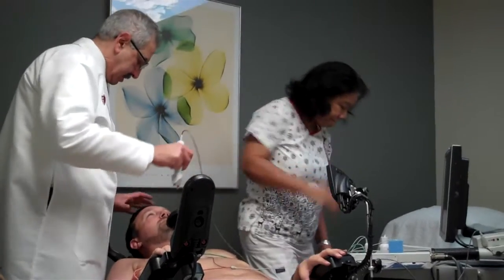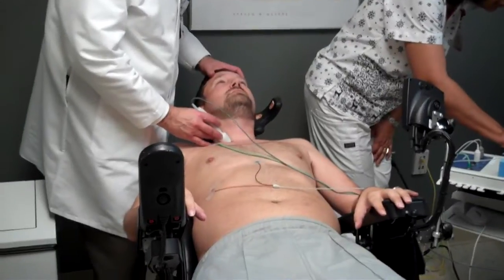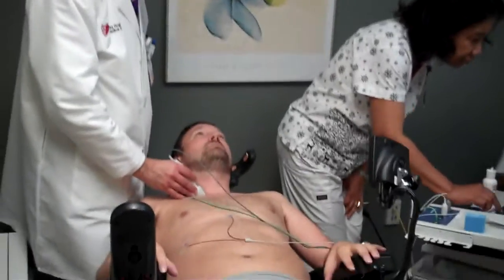You're good? Turn your head a little bit to the side. Is it mostly your arms or legs? A little bit of both. Let's back it up a little bit — put your head. It's going to feel like a hiccup. You don't have any hair.